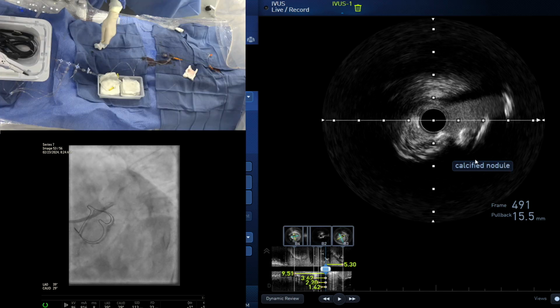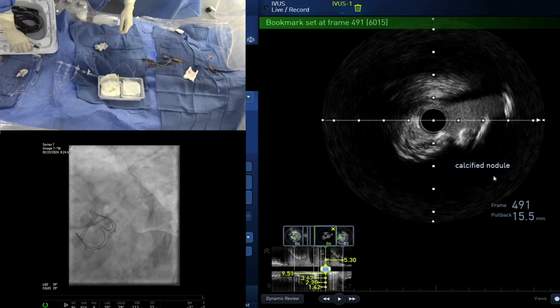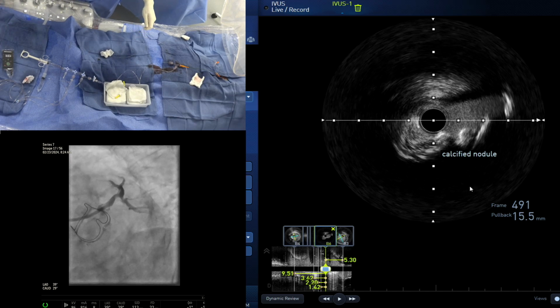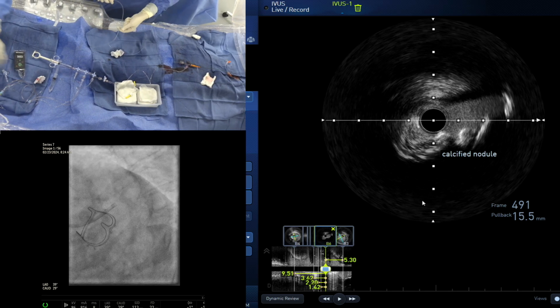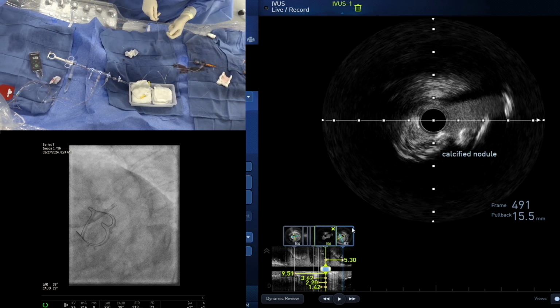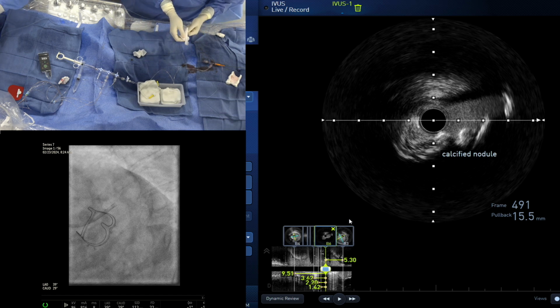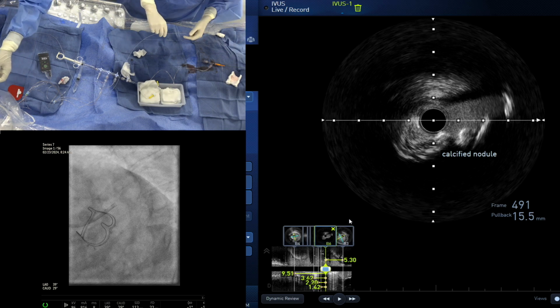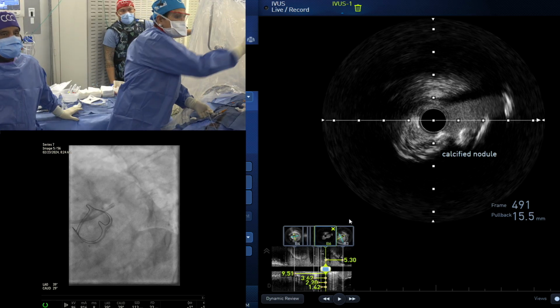We did have original data with OCT, but it was not necessarily calcific nodule. We found better, deeper cuts using orbital versus rotational atherectomy. So even if the lumen is 1.58 and you use a 1.5 burr, it's going to shave it. Why? Because the wire will be in the lowest, most concave portion of the lesion, and so it's going to shave it. Anu, you want to add some point? Yeah, the most important point, I think, since the beginning of this live case, they keep talking about bigger burr size. If you see here, this is a 90 degree, okay?